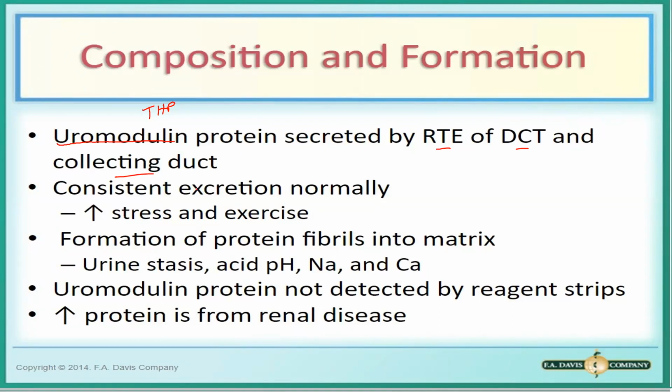Other components of your casts could also be albumin and globulin. Excretion of Tamm-Horsfall protein is consistent. Nag-i-increase lang siya because of stress and exercise.